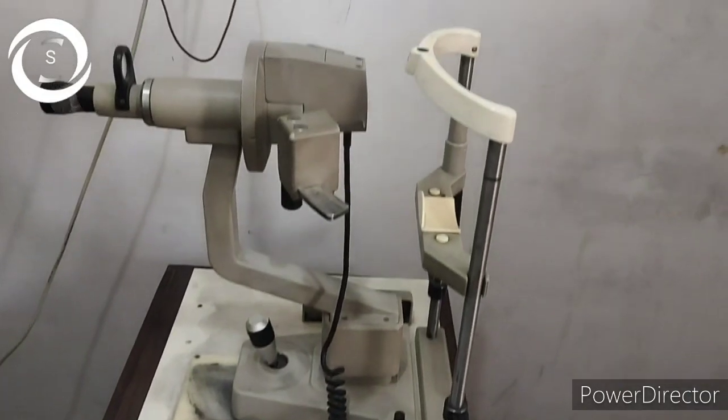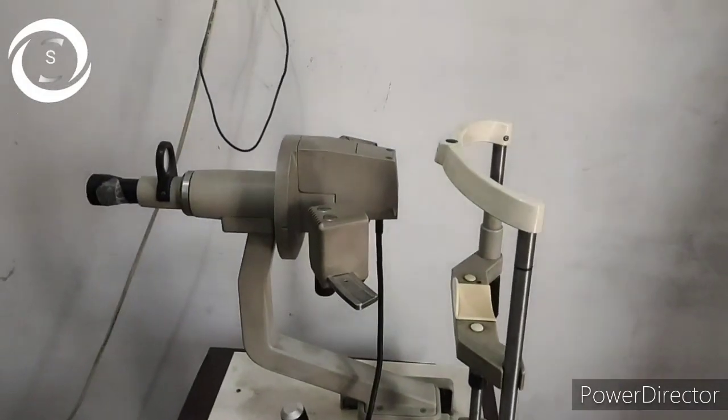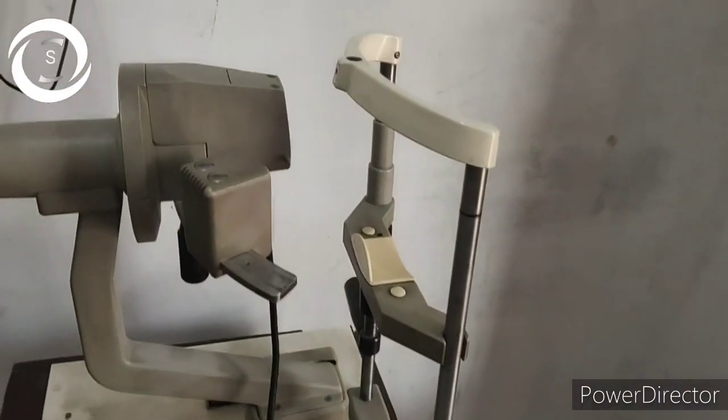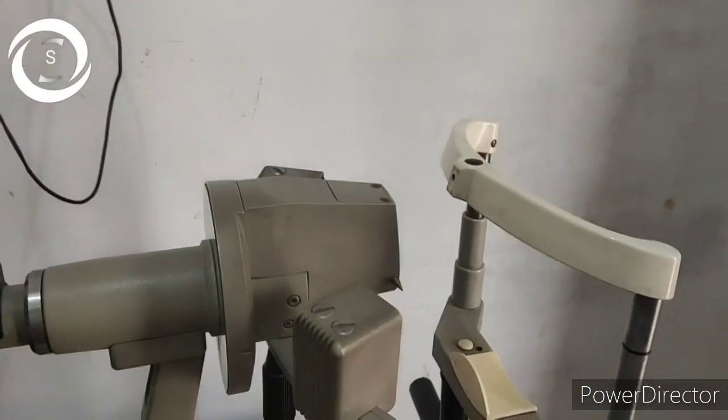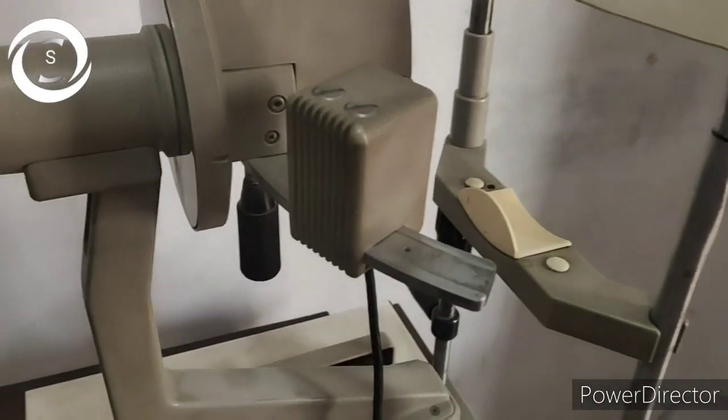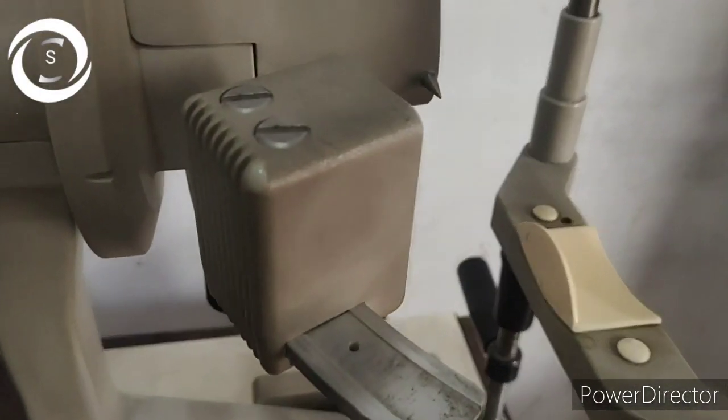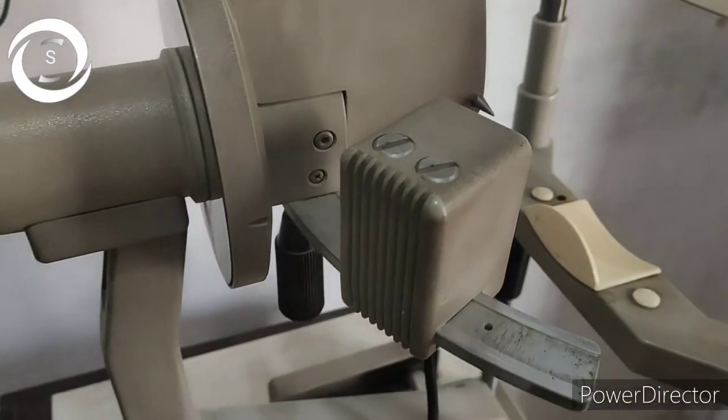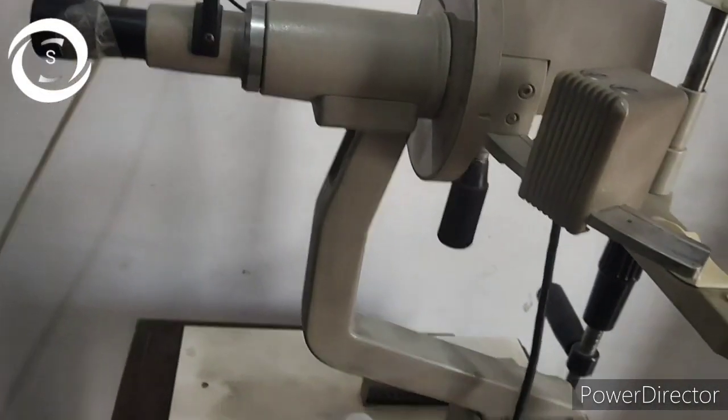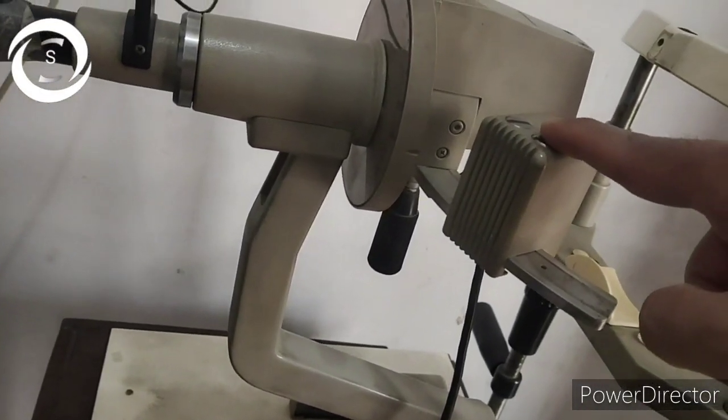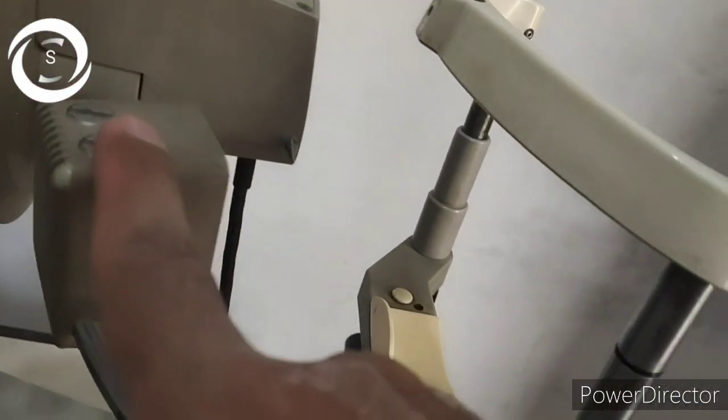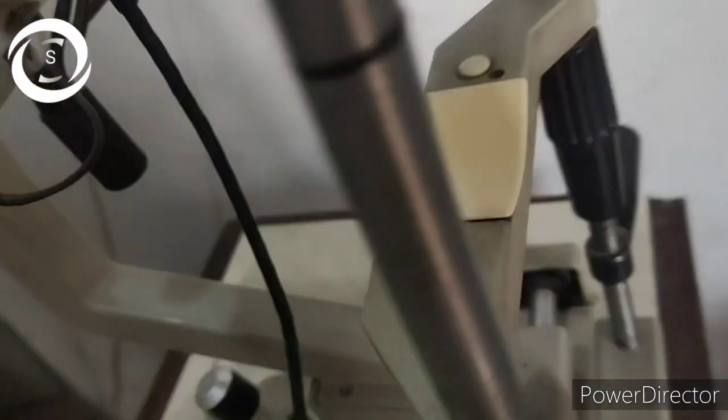Now this is Javal-Schiotz manual keratometer and you can see the chin rest, you can see the two objects and you can see the black knob. Here you can see the black knob that changes the distance between the two objects. Superiorly there is a dial in which there is axis in degrees and power in millimeters and diopters. Now these are the objects, this is one object or half part of the object.